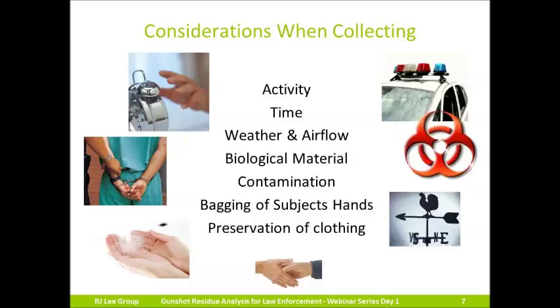When collecting samples, it is important to try and sample around the areas that have a lot of biological material present. So contamination from other sources is another issue to consider when collecting samples. Officers collecting from subjects need to be especially cautious as they and their surroundings can potentially contain GSR particulate. As mentioned previously, wear gloves and be aware of potential contamination sources around a collection area. If possible, have an unarmed officer collect the samples.